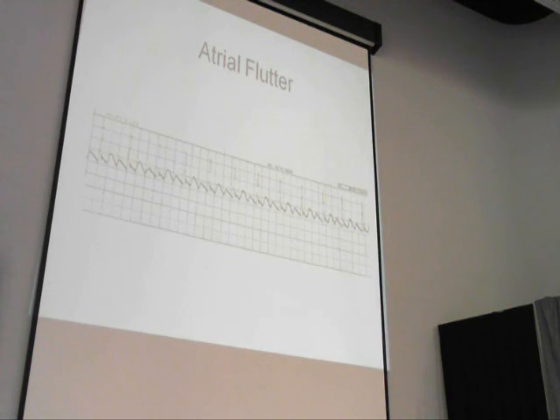I think I said last semester, I like to think that the AV node has female qualities, like intelligence, for example. There are some extra firing places outside the SA node making impulses. Like here, there are 3 abnormal flutter waves for one QRS.